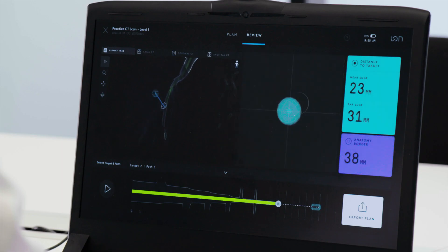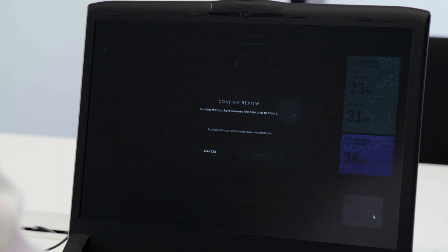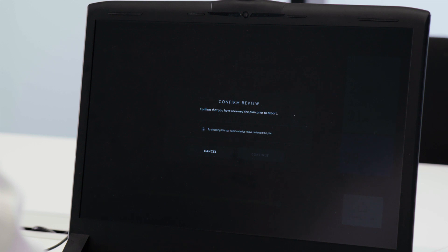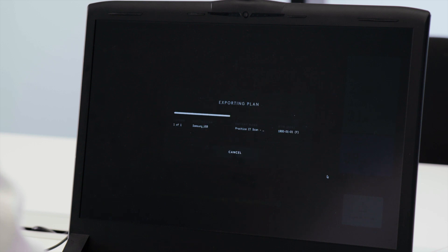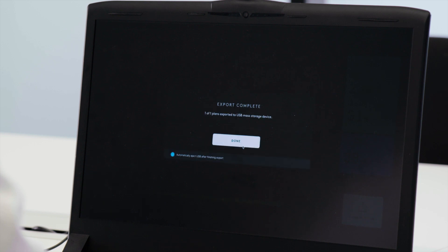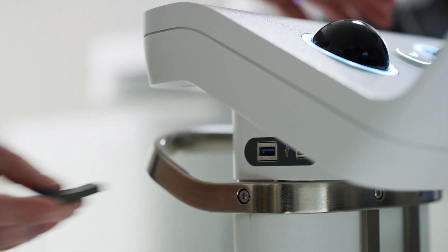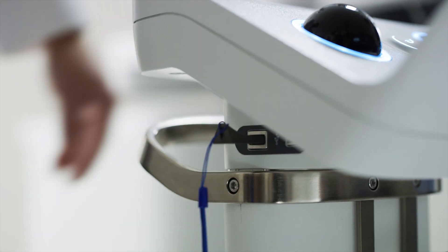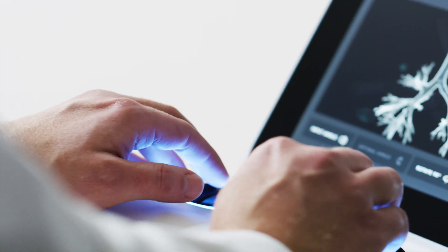Once the user has finished editing the plan, the user can then review the plan and export it to a USB flash drive. The user will insert the USB into Ion's controller to use during a case.